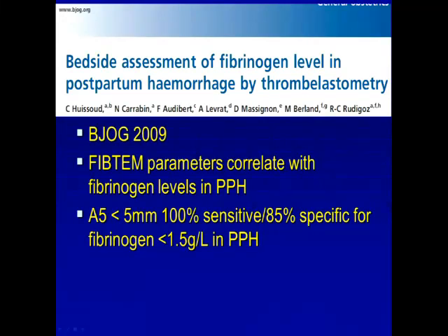It's a remote monitor. Exactly, we paid for that, so we will get that added as well. That involves Fraser Health IT, so there's been some challenge there in getting it through, but it all should come onto Meditech as well. Through that, they're going to have remotes, so the trauma team could be at home, and in ICU. Exactly, you can look at it from any portal that you can access Fraser Health through. Theoretically, look at it through your iPhone or iPad and see the result, the plot forming.